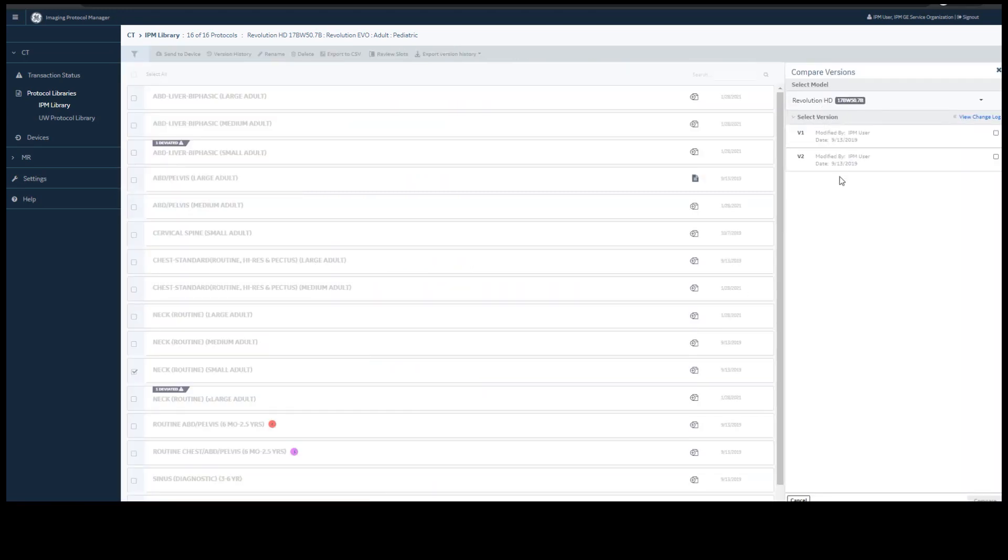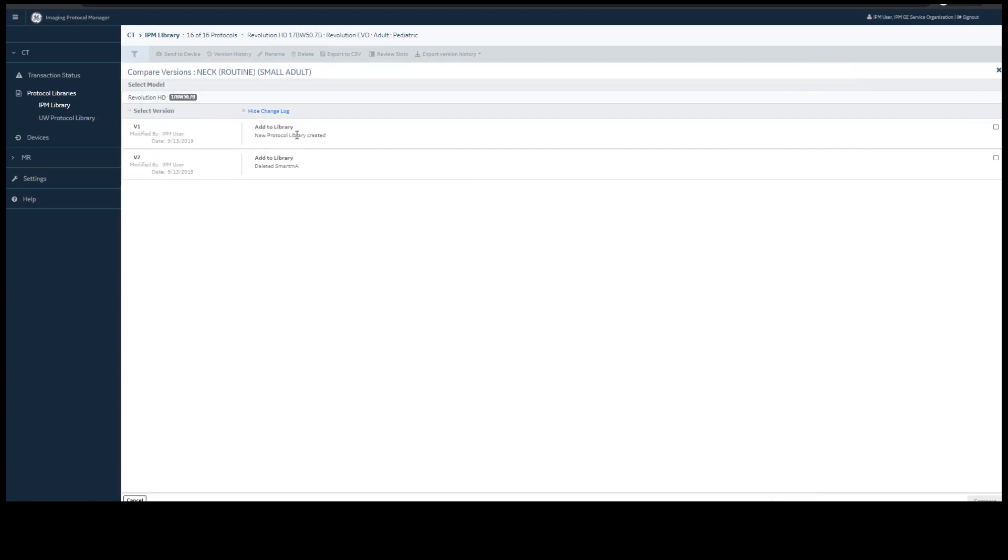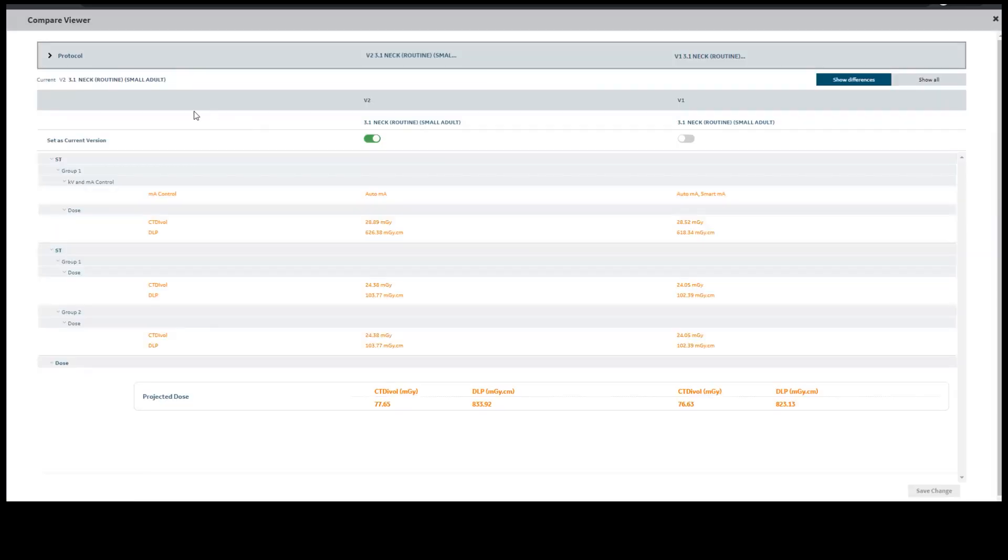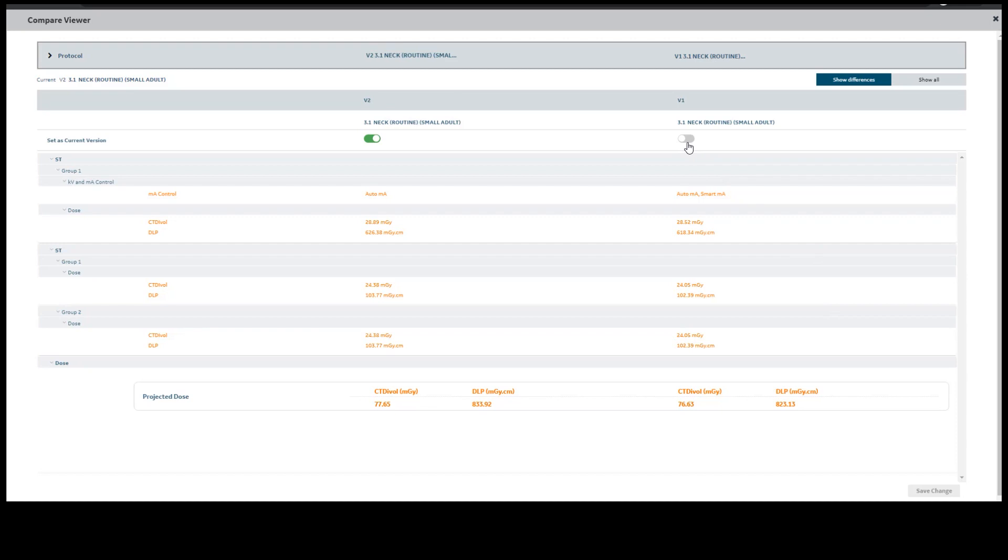You can compare two versions of the same protocol in the Compare Viewer that we saw before. This screen shows you what your current version is in your standard library. We also have the option to revert to any version that is not the current standard. If you decide to do that, you can slide the bar and save that change.